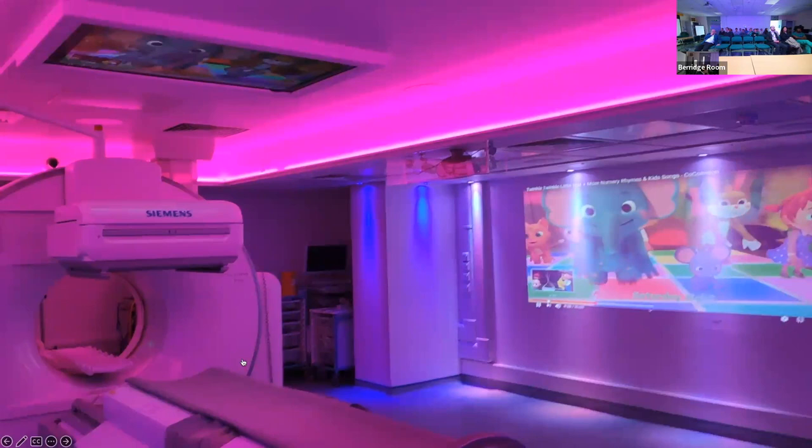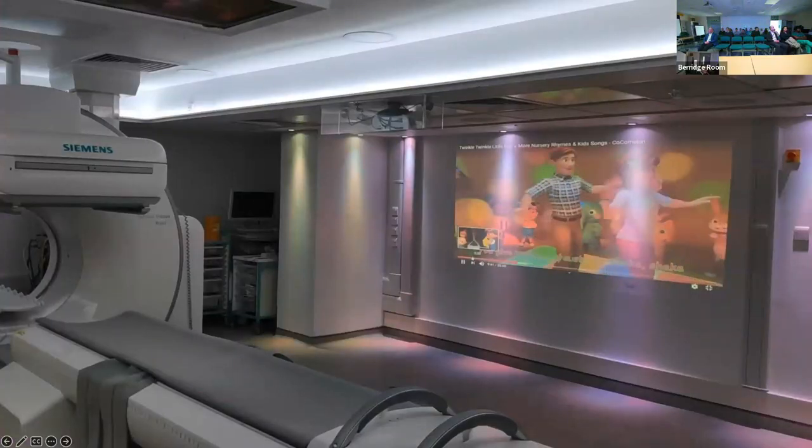For example, bone scanning, SPECT CT, is a different area, of course, but the child has to lie there on the scanner table for half an hour or so. The same with MIBG, not under GA, the same as a long examination. And if they have some sort of entertainment, they forget about the scan. They are much more cooperative and much more absorbed in following something. And then they don't move, basically, and the image quality is better.